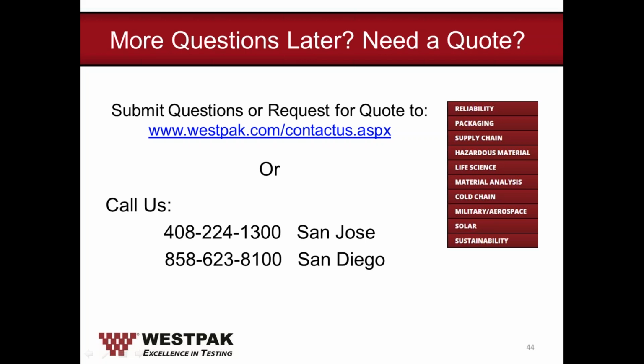However, my concern when you say a sealed plastic bag, I will be worried about the low pressure altitude portion of it. I'm assuming when you say seal, it's just taped down with a piece of tape, but just visual inspection will be adequate because it's not your sterile barrier protection. We got a comment back on that one. It was heat sealed. So that product was heat sealed.